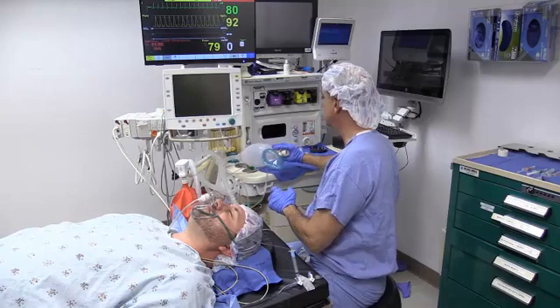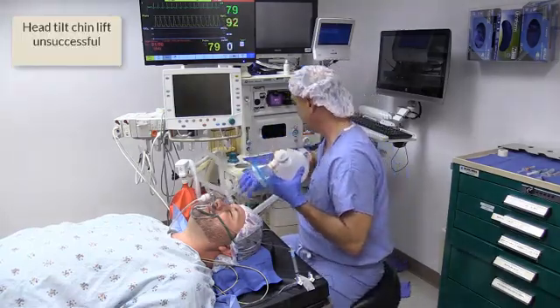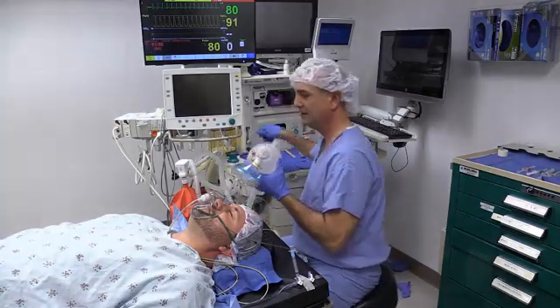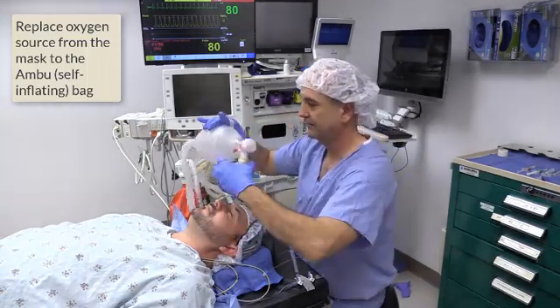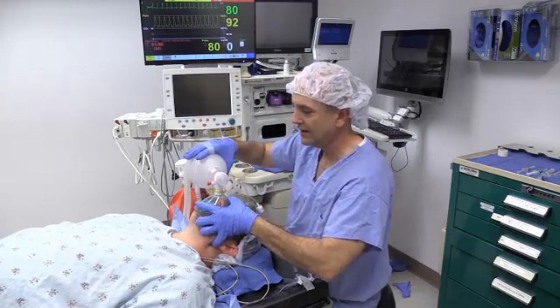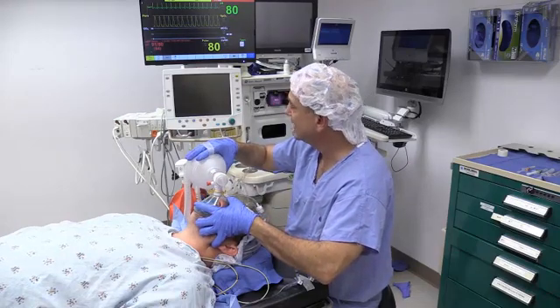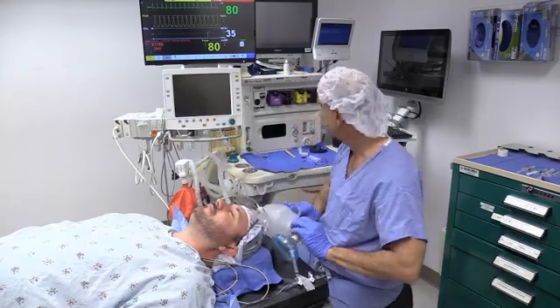My next maneuver is going to be to ventilate Mr. Jones. I'm going to replace the oxygen source from the mask to the Ambu bag. Replace this mask, holding the Ambu bag and the mask, lifting up on his airway and attempting to ventilate. As I do this, I see no end-tidal CO2 and no chest rise.